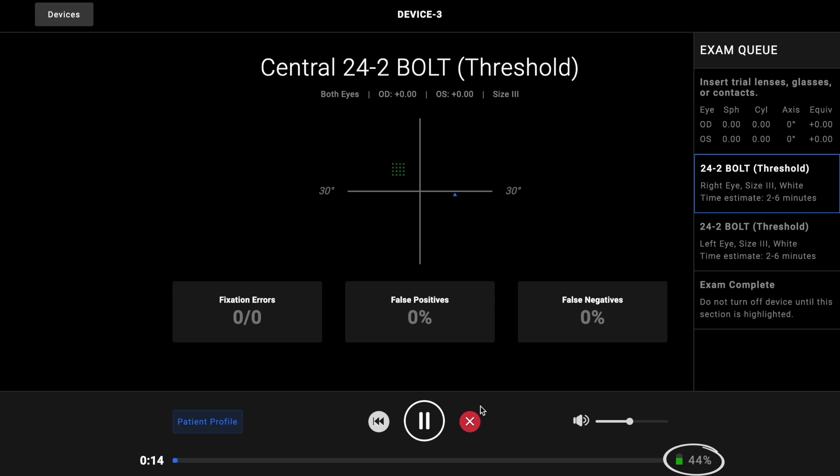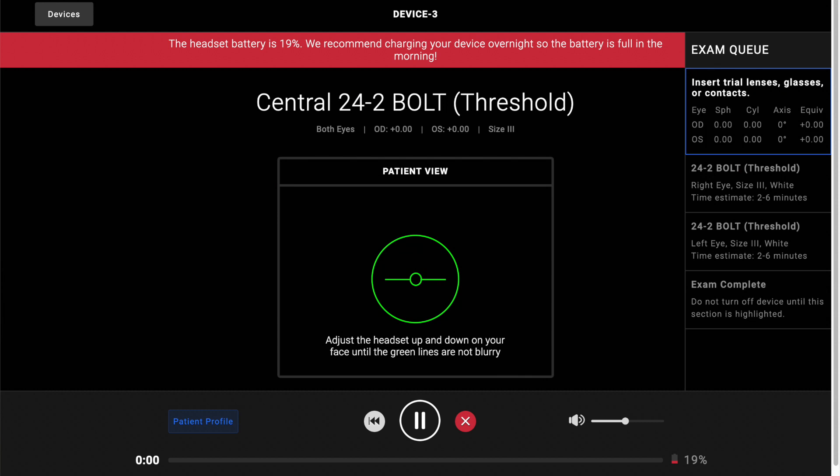For that reason, if you're not planning to use the device for several hours, we recommend holding the power button down to turn the device all the way off. The battery status for your device is shown on the progress page while the exam is running. It is important to keep the headset charged above 20% at all times so that it does not run out of battery during an exam. If the headset is below 20%, an alert will display on the progress page to notify you that the device should be plugged in.